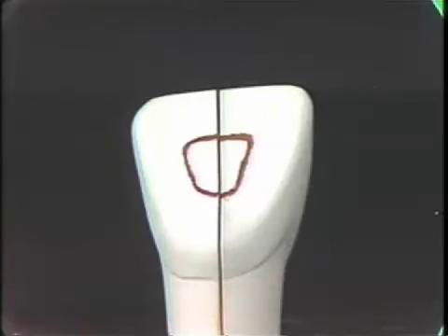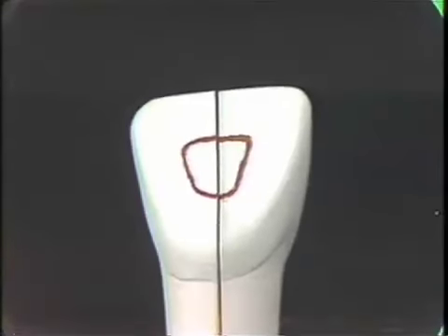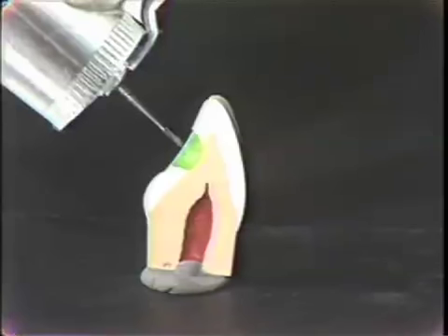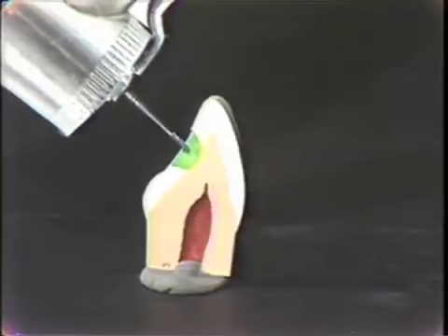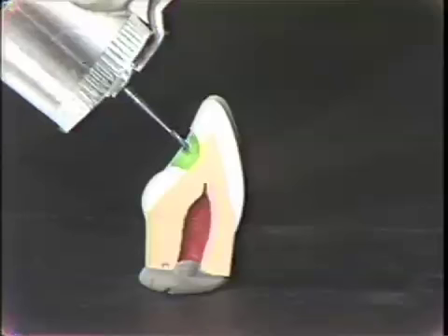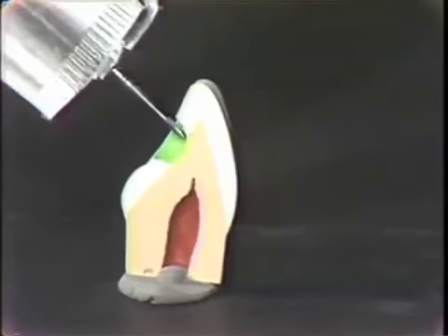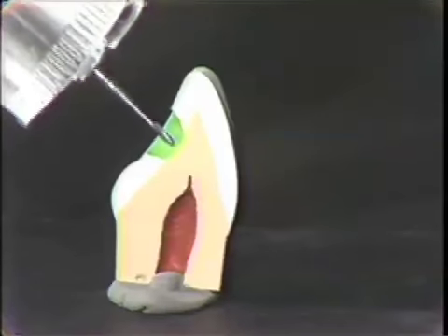If it'll help you, you can outline on the tooth with a pencil what you expect your tentative outline form to be. The third step is to establish your tentative outline form in the enamel with a high-speed 1057 burr. You hold your high speed at right angles to the surface of the tooth, so the burr forms a right angle with the surface of the tooth. You penetrate through the enamel to the dentin. You extend this laterally until you've roughed out your tentative outline form in enamel.